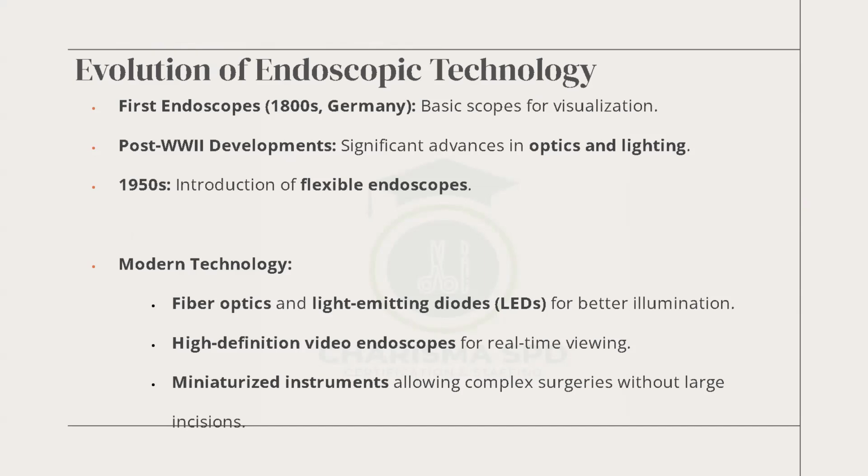Evolution of endoscope technology. How it started. In the 1800s, basic scopes for visualization were made in Germany.